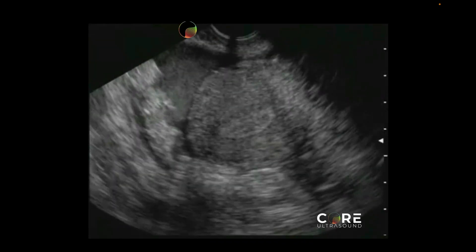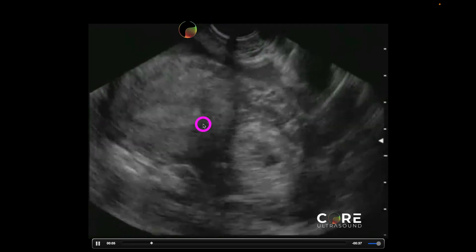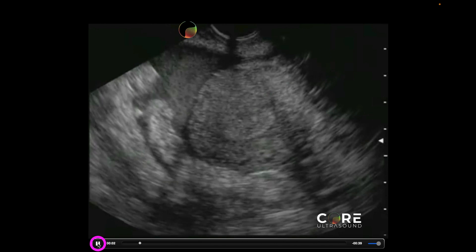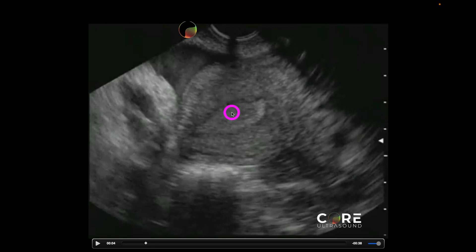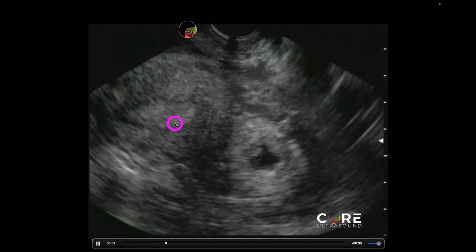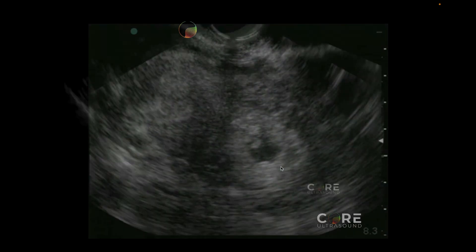Here is another ectopic pregnancy. This is the uterus using an endocavitary transducer, and we are seeing a bit of actual hemorrhage. We're seeing an endometrial canal right here with a little bit of blood in it, and around the fundus is where we should be seeing the pregnancy — but instead we're actually seeing it over here. This gestational sac is not in the uterus where we want to see it. This is what an ectopic pregnancy looks like.